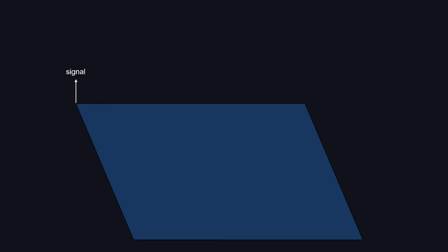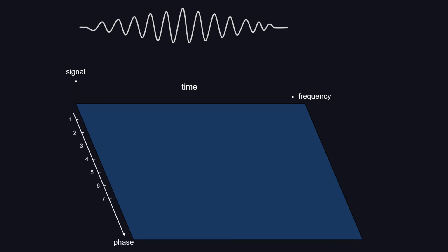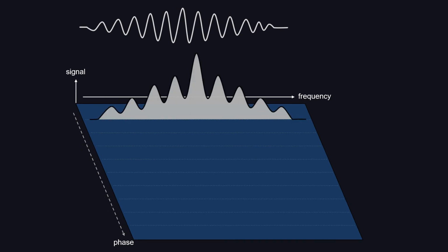Let's look at it the other way. In this case, in the z-axis, you have overall signal intensity, and you're sampling across an echo. And the signal will get stronger, reaches a peak, and decrease symmetrically in the shape of the echo. And you sample across time, and you have finished your frequency encoding. So you have not induced a phase shift yet. So your signal profile will look something like this. You have a symmetrically increasing signal intensity, reaches a peak, and symmetrically decreasing signal intensity, a signal of an echo.